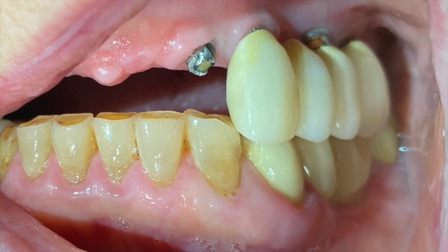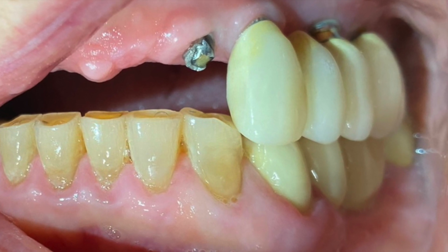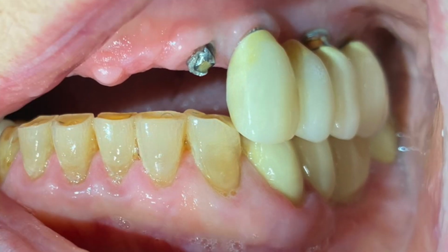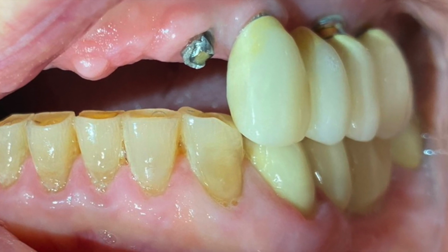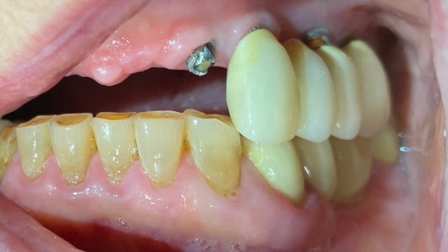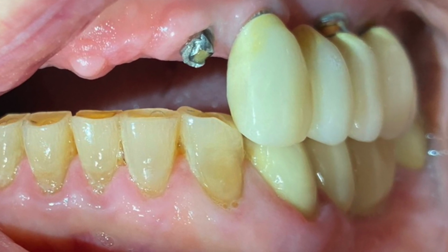Back to this case, what amazed me for a very long time, speaking firstly for myself, is that I've been looking only at what's happening, not why it's happening. So looking just at the fractures without looking at the opposing arch, what happens in the lower arch, was a big mistake for a long time in my practice.